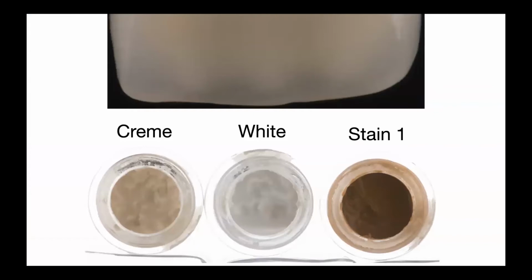And now I'd like to say a couple of words about the halo effect. We can use cream as a universal stain to create it at the time of staining. And I use this stain and this technique even when I work with porcelain, and create my enamel area in 3D with the help of porcelain material. And after the crown is finished, technically it's not a problem to create the halo effect with the help of this stain.